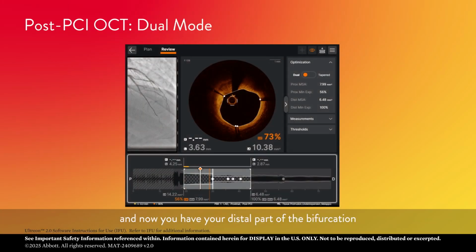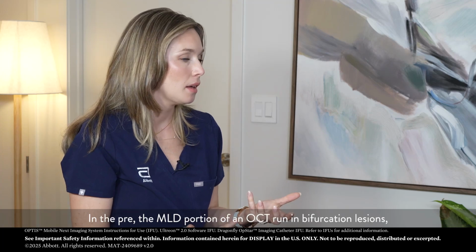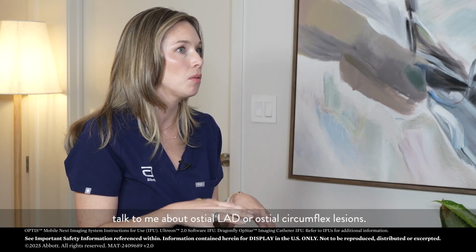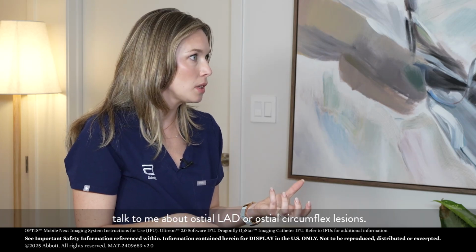And now you have your distal part of the bifurcation with a completely different target reference. Right. In the MLD portion of an OCT run and bifurcation lesions, talk to me about ostial LAD, ostial circ lesions.